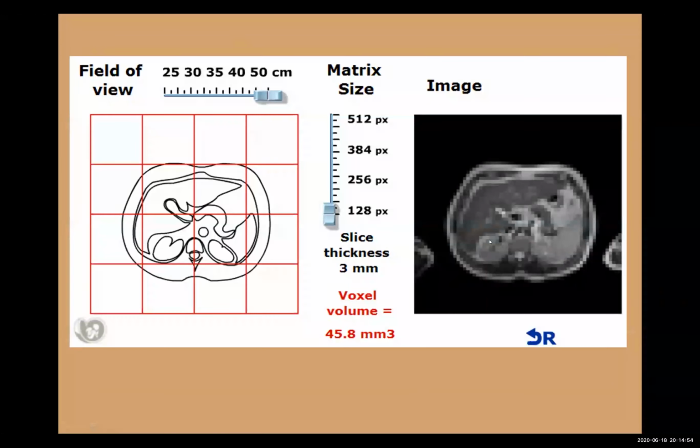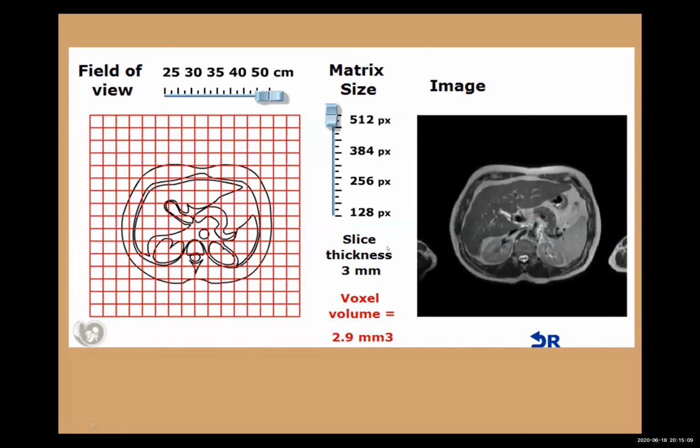So as you can see, resolution is represented by the number of pixels. This is not a very good image because you see there is a lot of averaging there. You cannot see any details in this image compared with this image, which has much better resolution, because we can see details, boundaries, and edges, and that all can help us to understand what pixels mean.